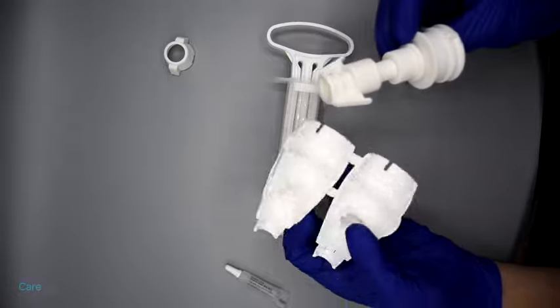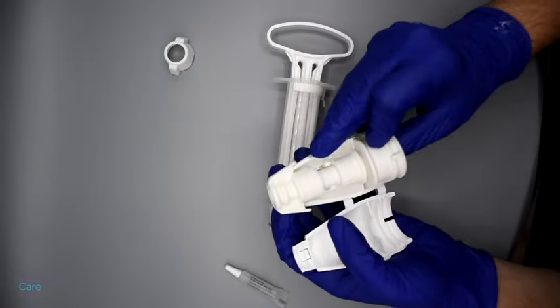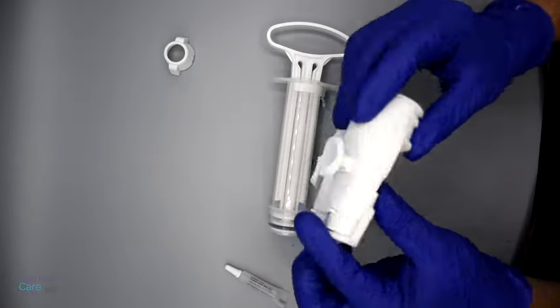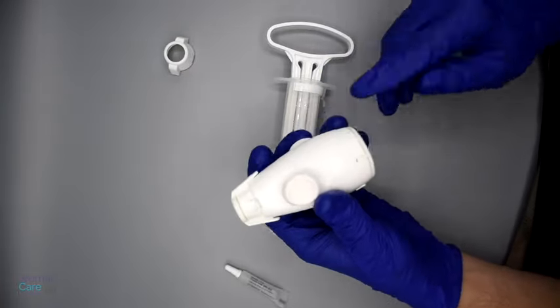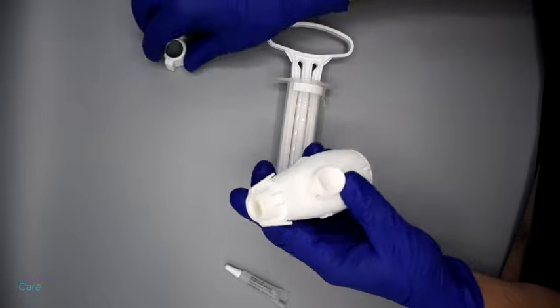Place valve liner inside the valve by aligning the internal ridges. Close the valve and ensure the tabs extending from the sides of the liner are on both sides of the valve.